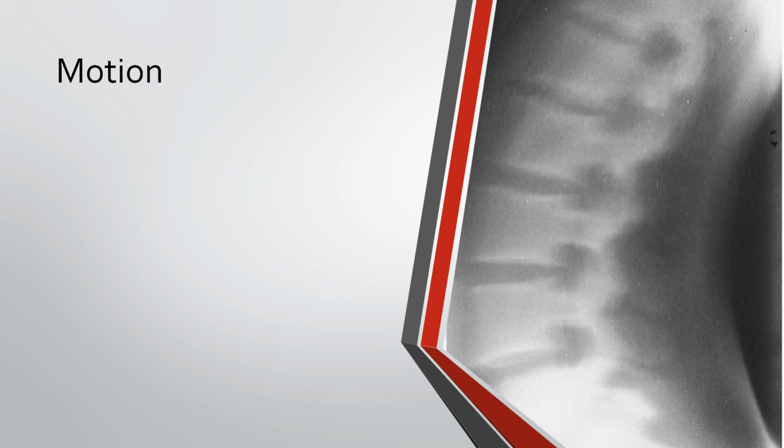Let's talk about motion on the image. Motion is a huge killer for any image when you're taking a picture on your own, right? If there's any kind of motion involved, it will be blurry, it'll be unclear. It's hard to see details in it, right?